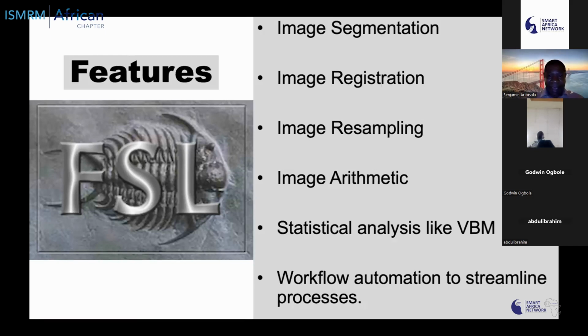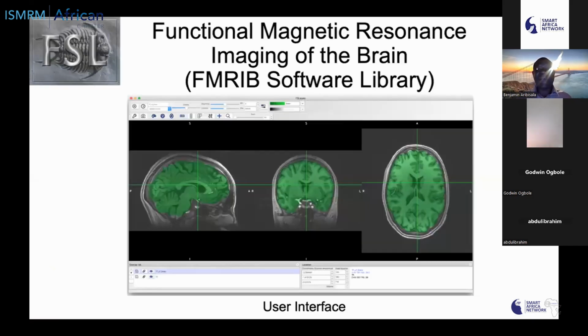And finally, here on FSL, FSL is typically developed to run on Linux, but it can work on Windows as well. So you can do the installation on Windows now. And so if you have a Linux box or you have a Mac or Windows, you are really good to use FSL. All the processes you want to do, you can arrange them as a pipeline and just batch them, which makes life so easy. And that is FSL for you.